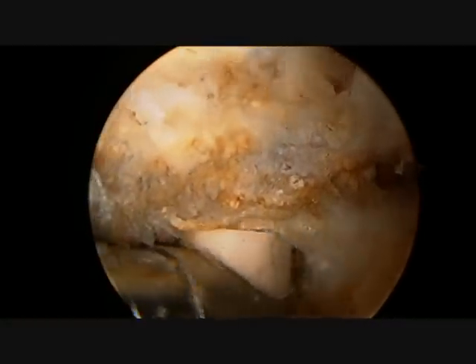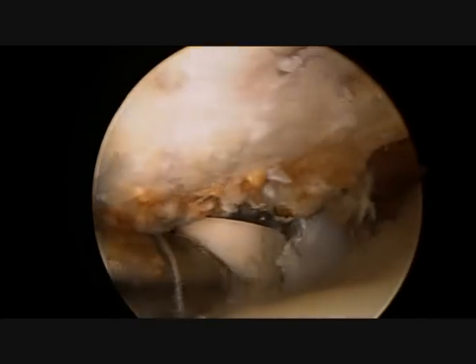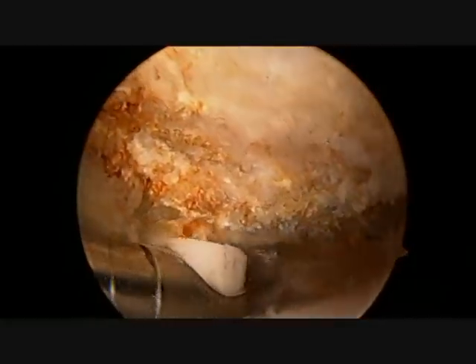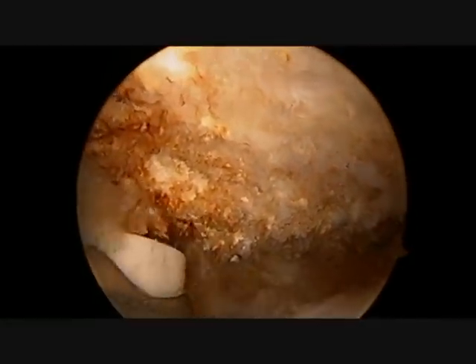The anterior or front half of the spur is completely exposed so that I can see the deltoid muscle in the front of the shoulder. I will then remove the tissue from the lateral or outside of the acromium, which is where most of the impingement or pressure of the bone spur on the rotator cuff occurs.